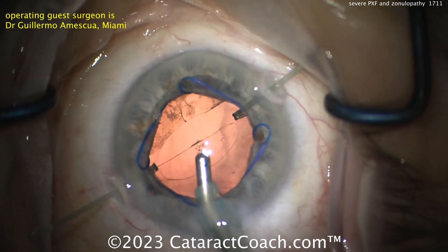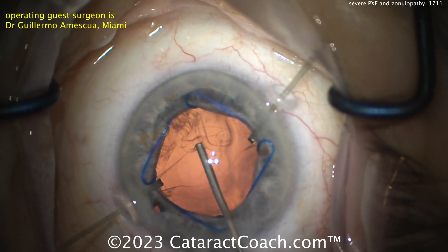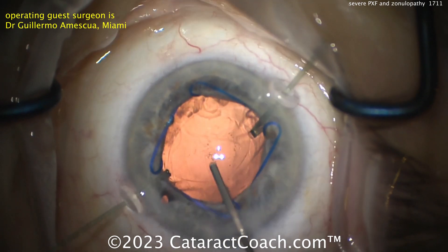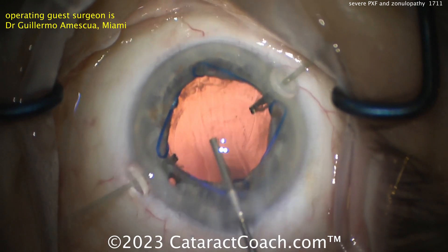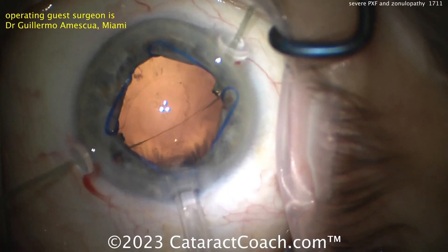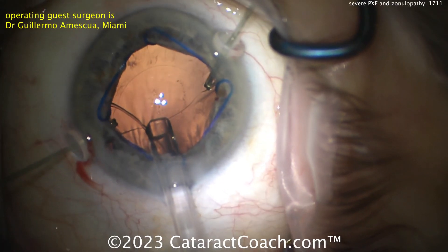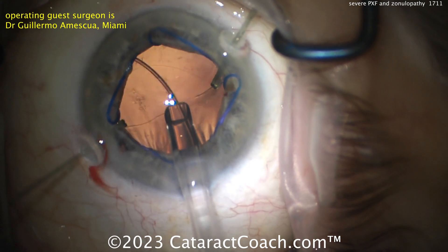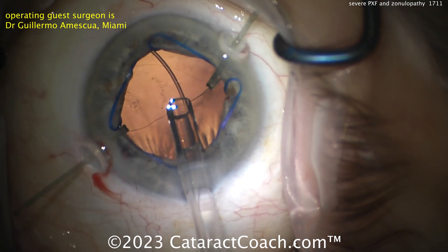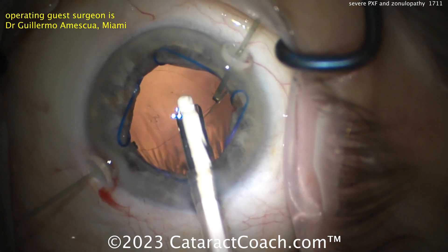Cleaning up the capsular bag — you obviously want to clean up as much as you can because you don't want too much fibrosis or contraction later. Filling up the capsular bag looks a whole lot better. Now here comes a CTR. I like to hold the leading part of the CTR with a Sinski as it's being delivered, going into the capsular bag all around. Looks great.